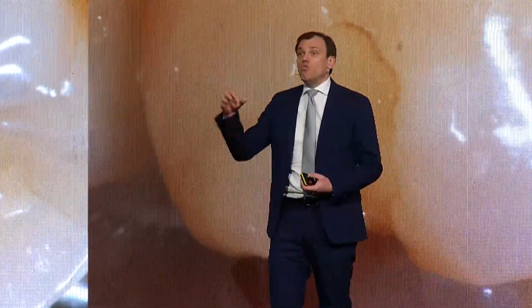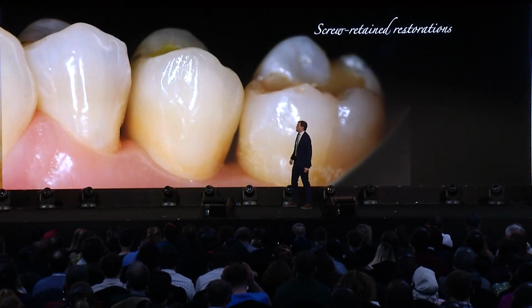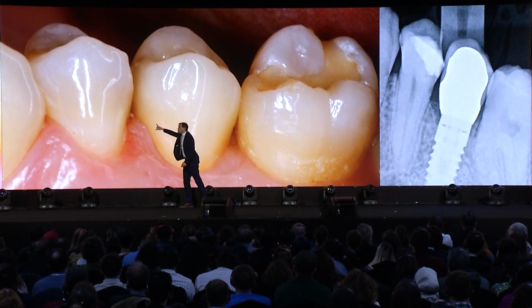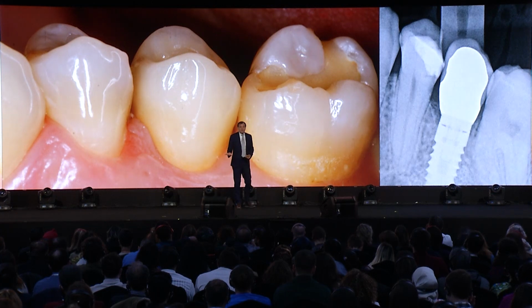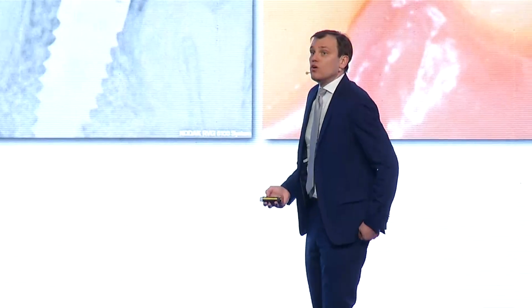And the tissue behavior really depends on what we give to those tissues. And they can really grow if we give the right material. It can really grow, close our black triangles, and result in a more aesthetic appearance. Maybe that's what we should be always using. I'm thinking, if it's a magic material, if zirconia is a magic material, why don't we use it all the time?